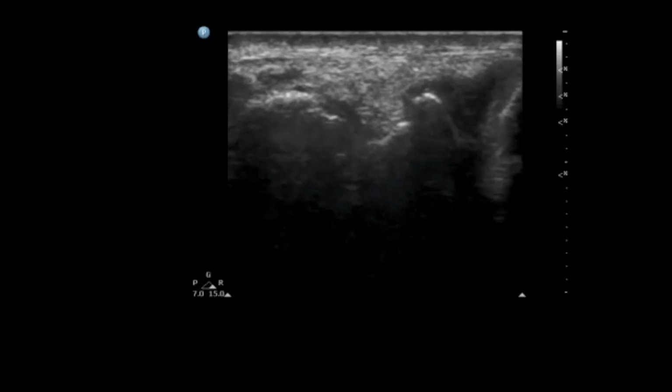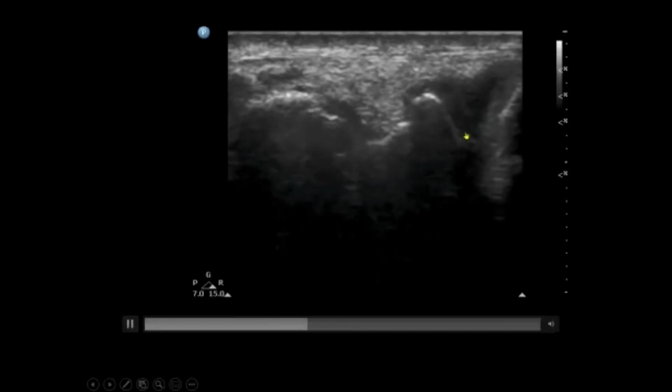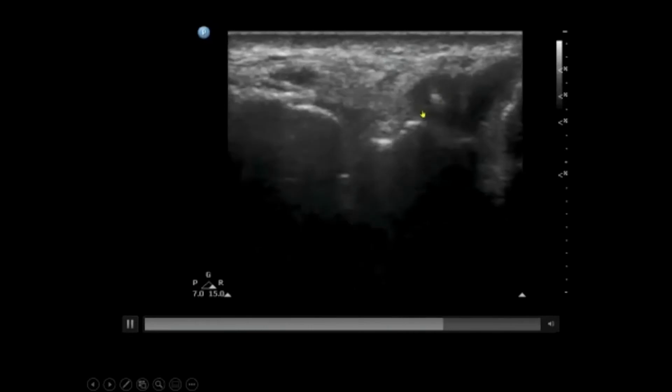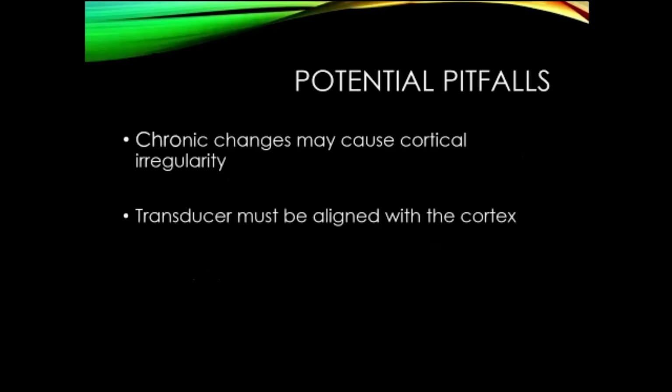And then you can look at the left side, and you'll notice the distal hump, or having an area here where the cortex, you can't really quite seem to line it up. And this is sort of one of the pitfalls of doing bone ultrasound. That's actually someone who has arthritis between their scaphoid and their trapezium, and it causes cortical irregularity.